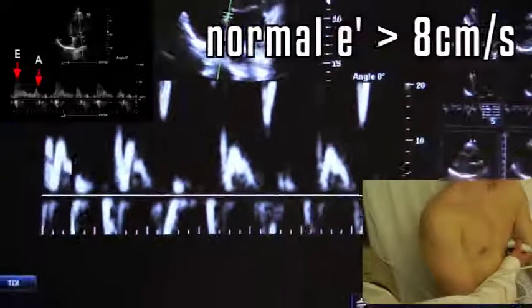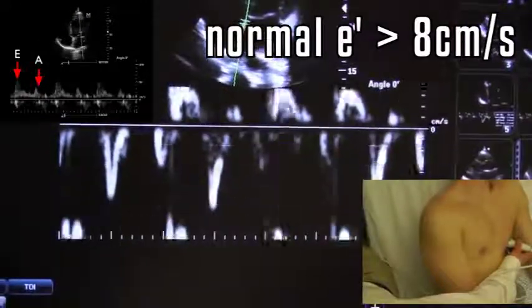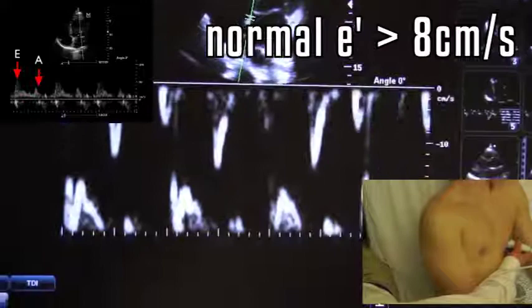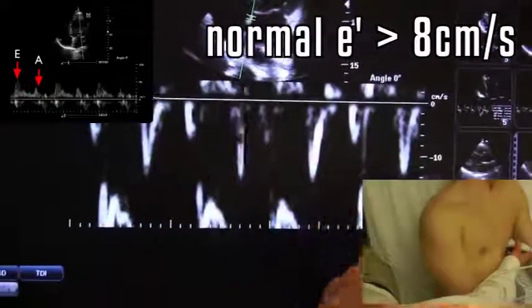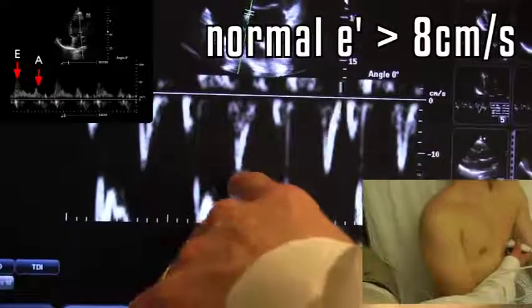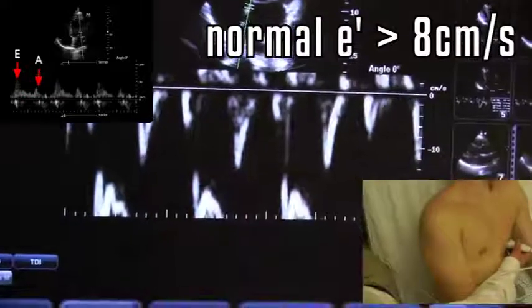In this case, E prime is greater than 10 cm per second, which is normal, because anything less than 8 cm per second suggests diastolic dysfunction.